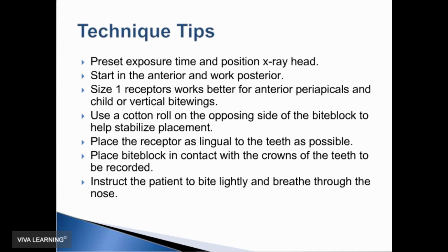Just some tips to help you get organized. It is always a good idea to preset the exposure time before you place the receptor and have the X-ray head close at hand in close proximity to the area of interest. It is very important to make sure that you're setting the exposure time for each view you take in the mouth, particularly with digital receptors. Underexposure does not allow a complete record of the information to be transferred to the digital receptor.